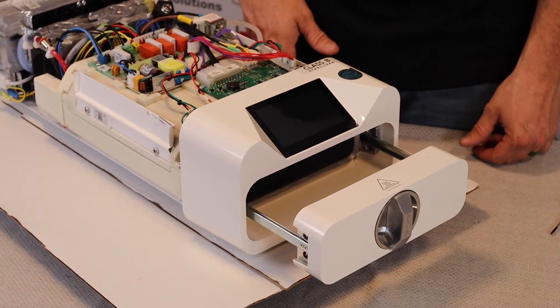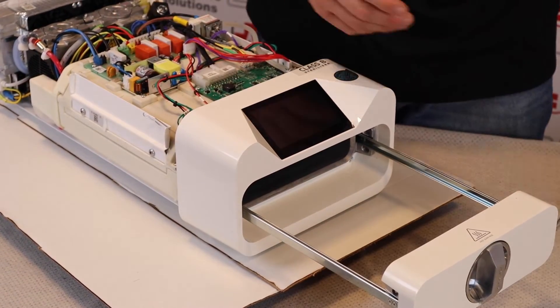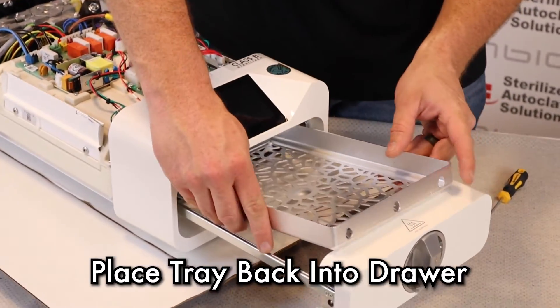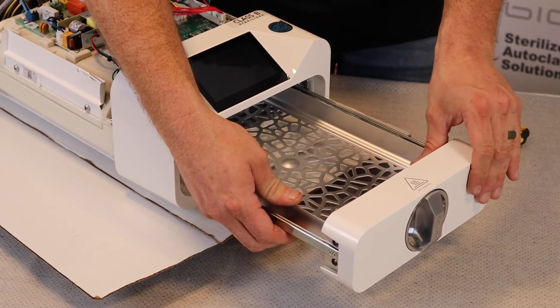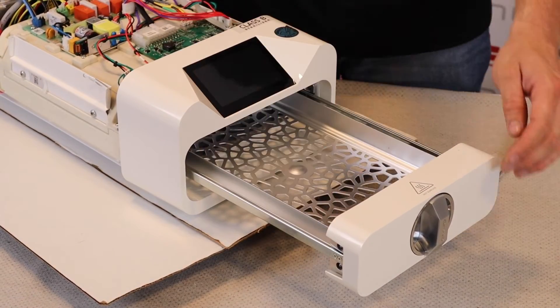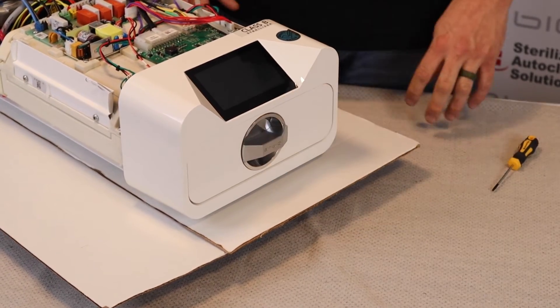Once those four screws have been reinstalled and tightened down, you can take your tray with the three holes in the front, slide that in, and on the three nubs that are on the seal, the door will slide into place, and your door is reinstalled.